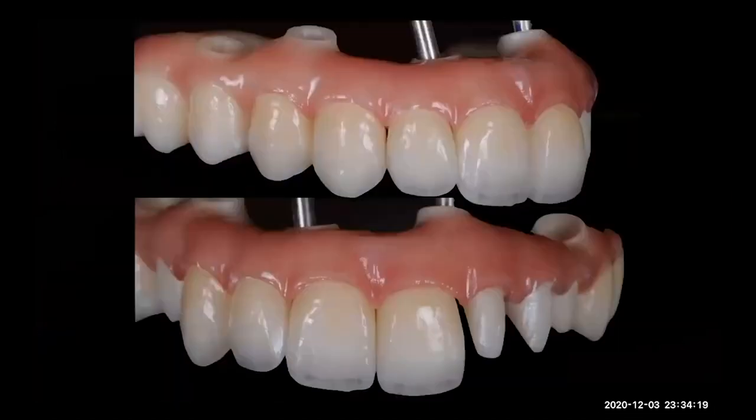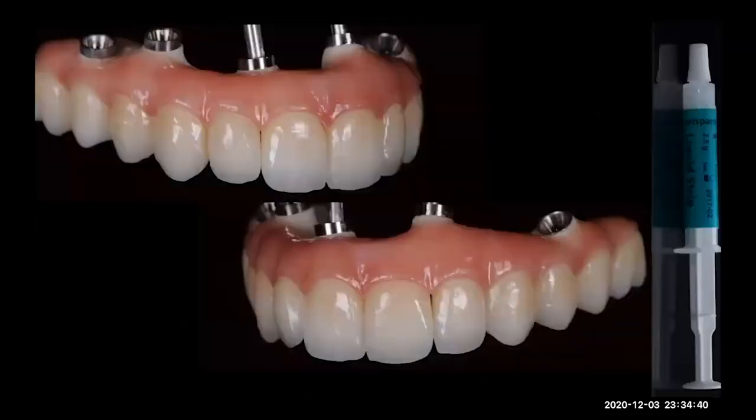And now we have everything done buccally. You see, we have our contours, our color. When we are happy with the colors, and of course, we already have some internal characteristics in the incisal area. And you can see the translucency we can create with the calibration of the wax. Now we are focusing more on that. And now we have already filled all the spaces with different ceramic.